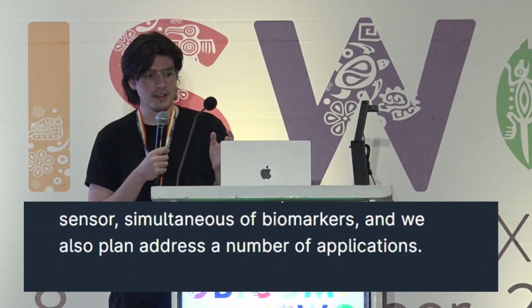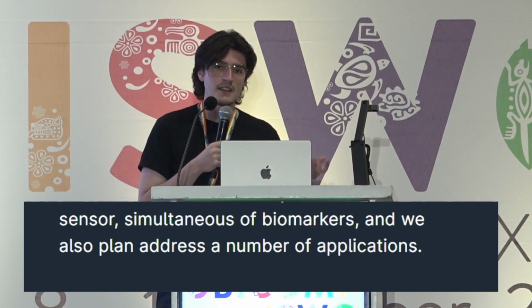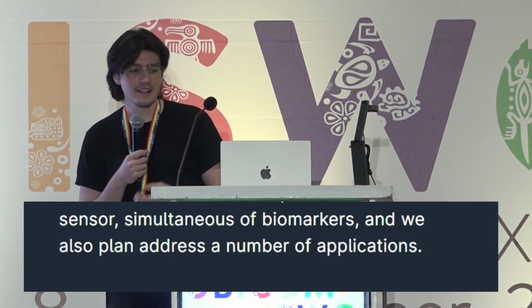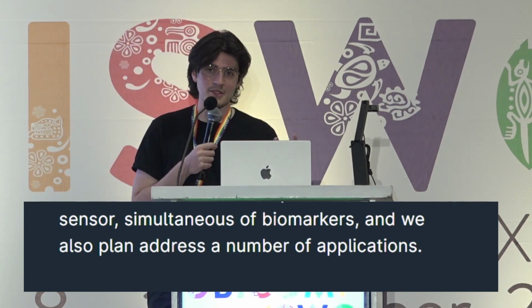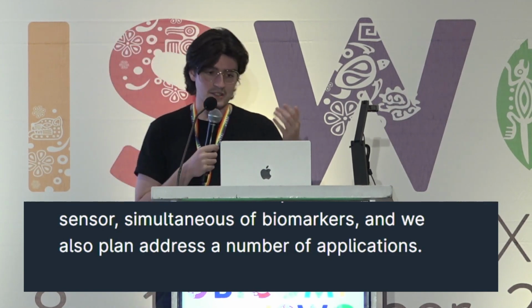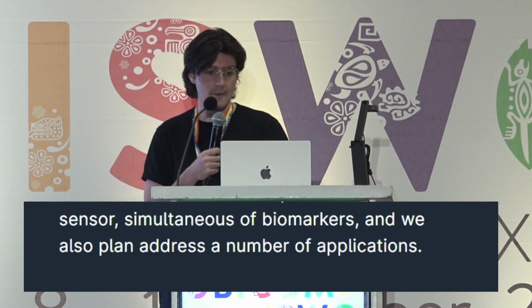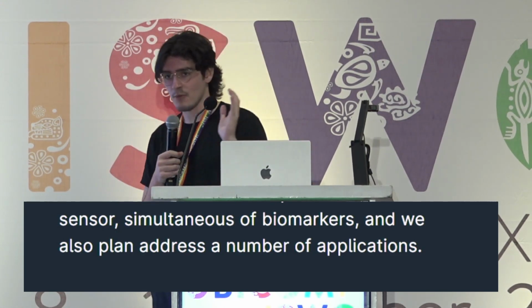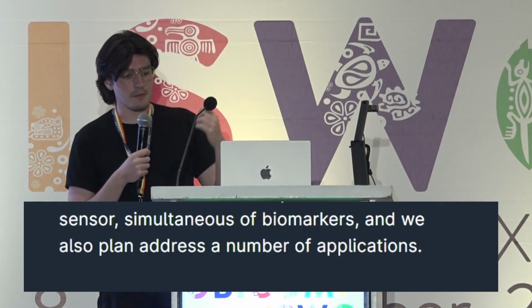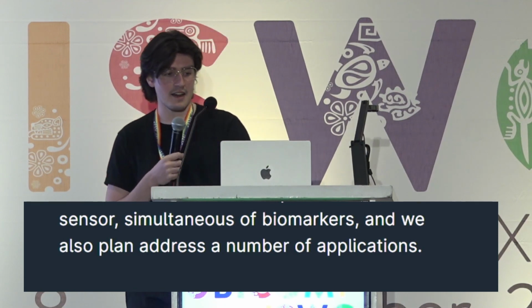So some early experiments showed that when you bring the phone in contact with the user's body, what you see is an inverse exponential curve like this, where after about 8 minutes of contact, the temperature of the thermistor equilibrates with the core body temperature of the user, which we found to be basically the same as the temperature of the user's forehead. And we found that with warmer foreheads, or people with warmer core body temperatures, this point where the temperature converges to after 8 minutes obviously increases.